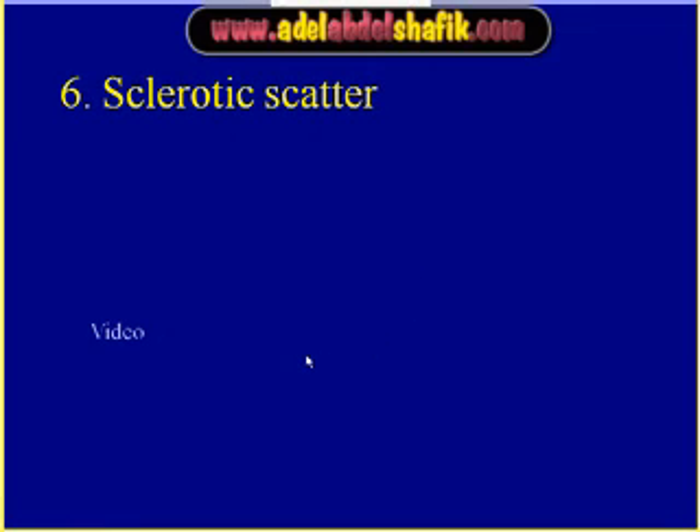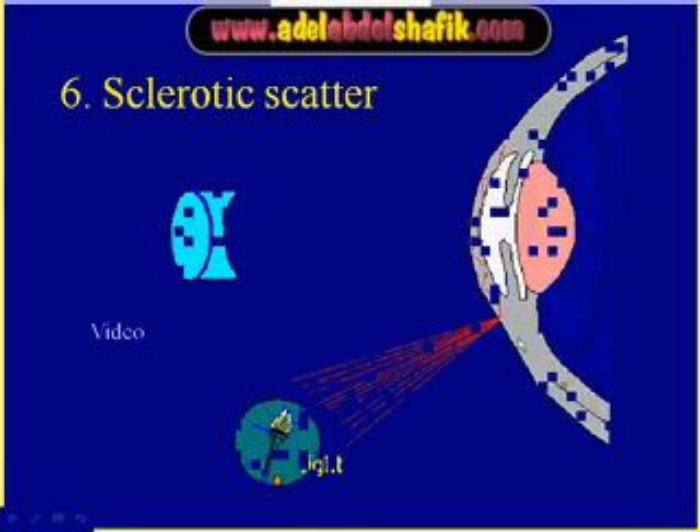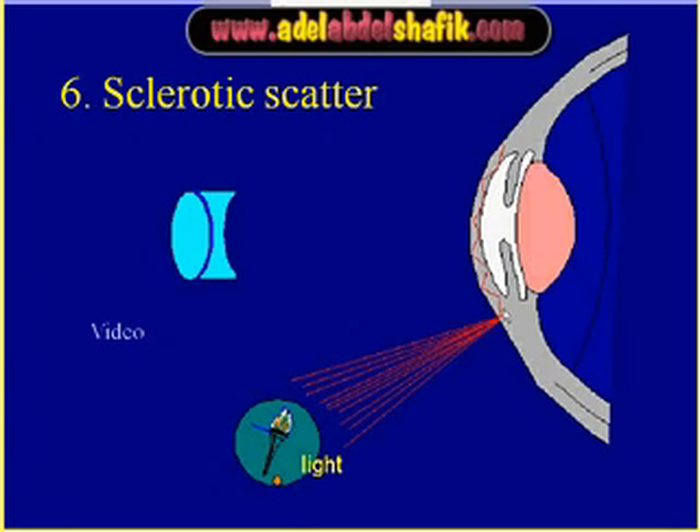This method of examination is called sclerotic scatter. We place the light at the limbus, and the light undergoes total internal reflection between the anterior and posterior surface of the cornea until the opposite part of the limbus is illuminated. If there is corneal edema or intracorneal lesions, they will be more apparent using this technique.